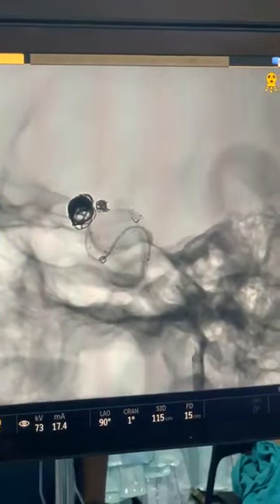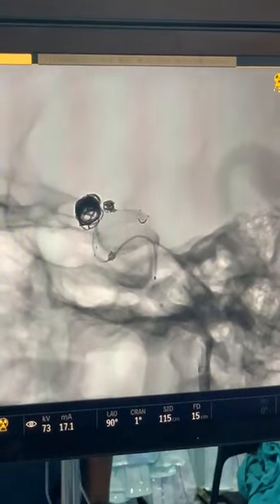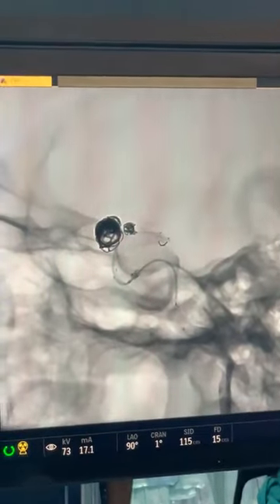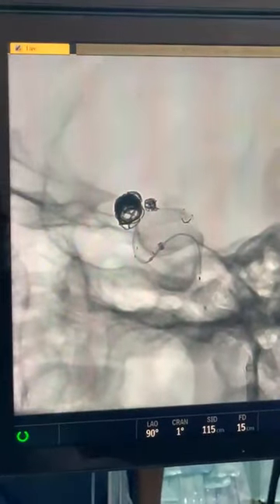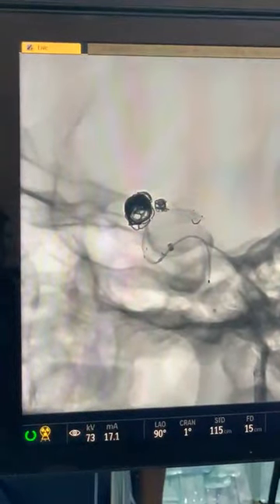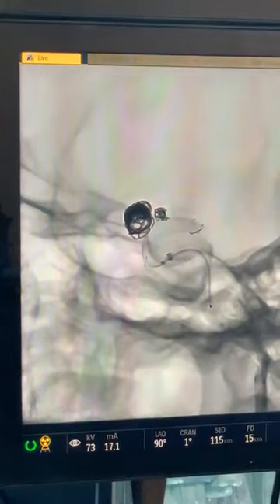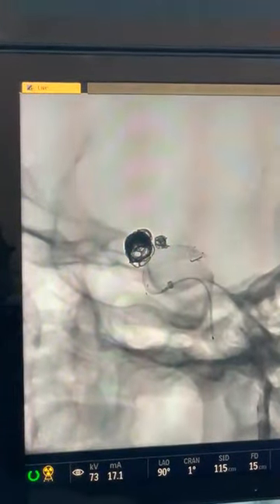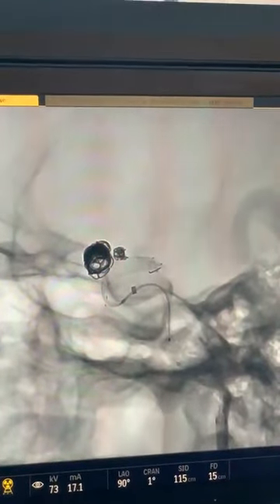It's always a play. So now in the bend it's not opening, so we will play with it a little bit. And you press it a little bit.